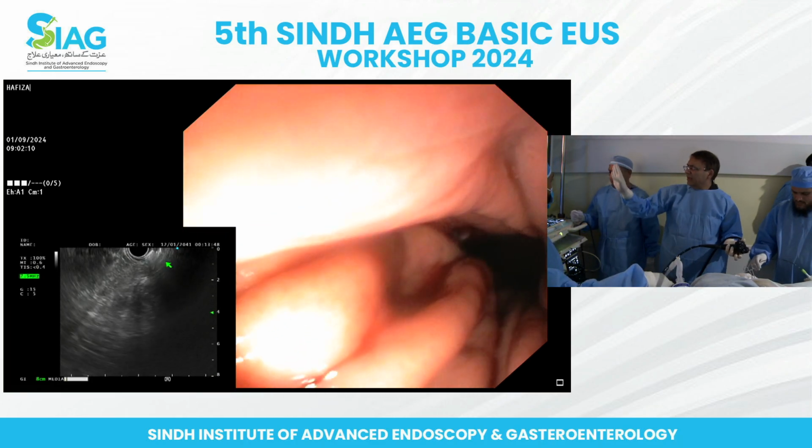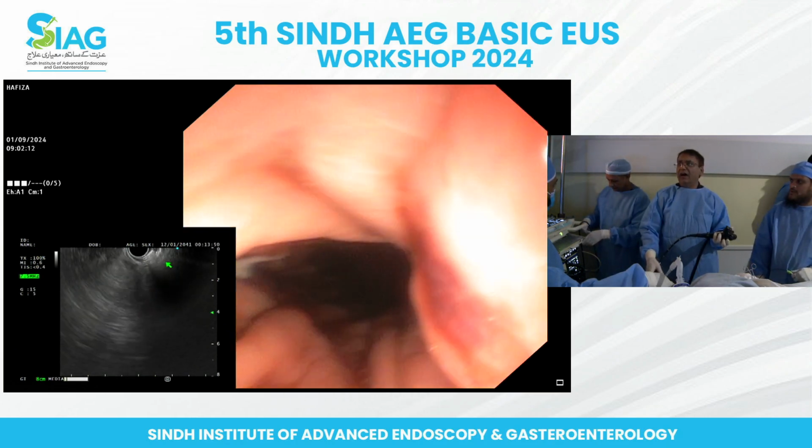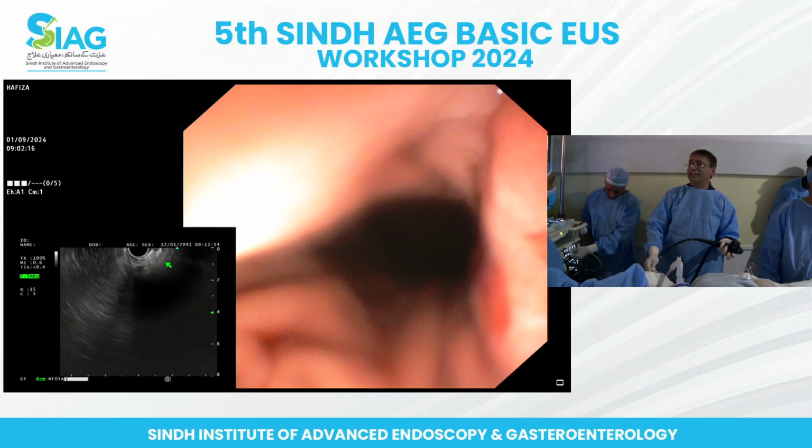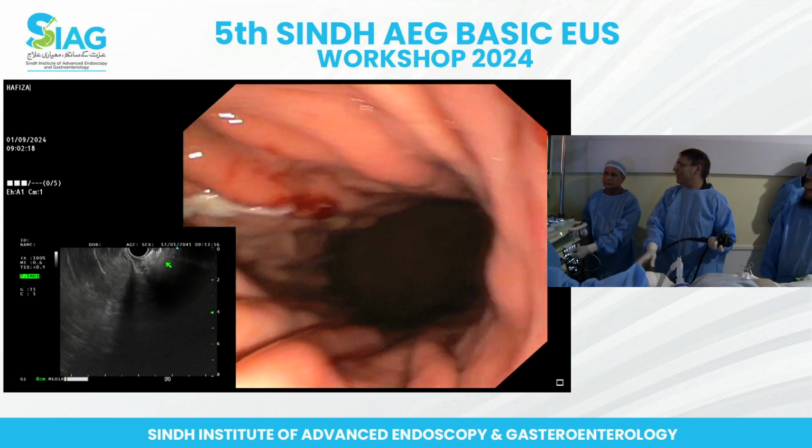So this is a little bit of blood from the FNA. So I'll blame Shahzad and Afan for that. Anyway, no, this is nothing.